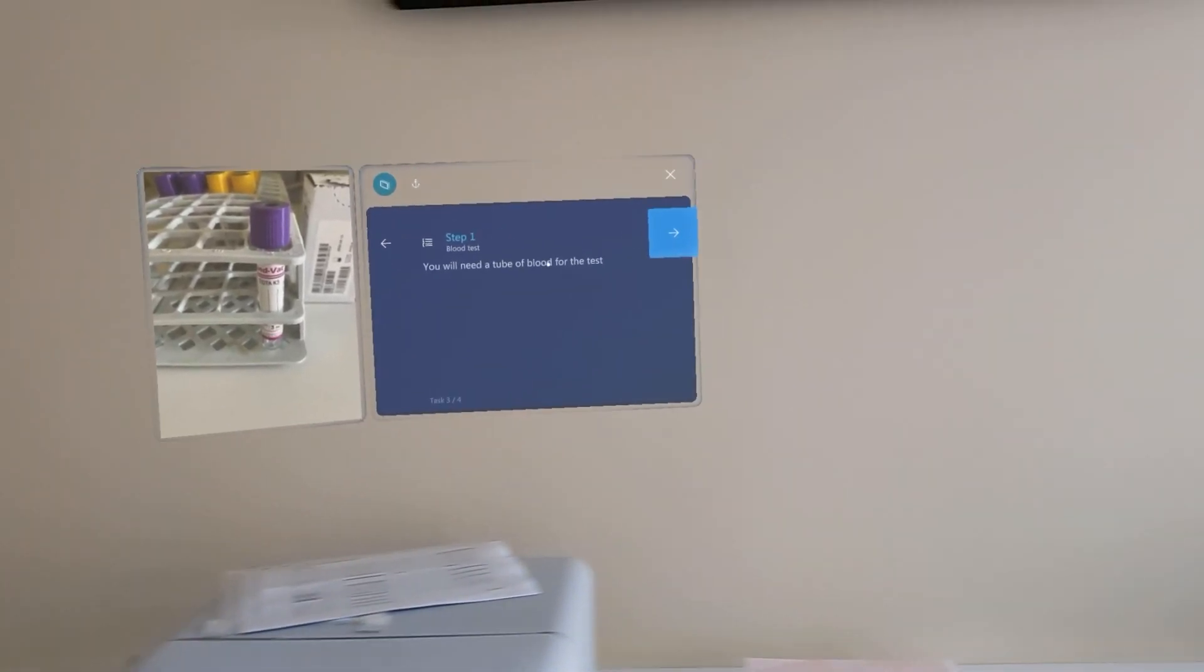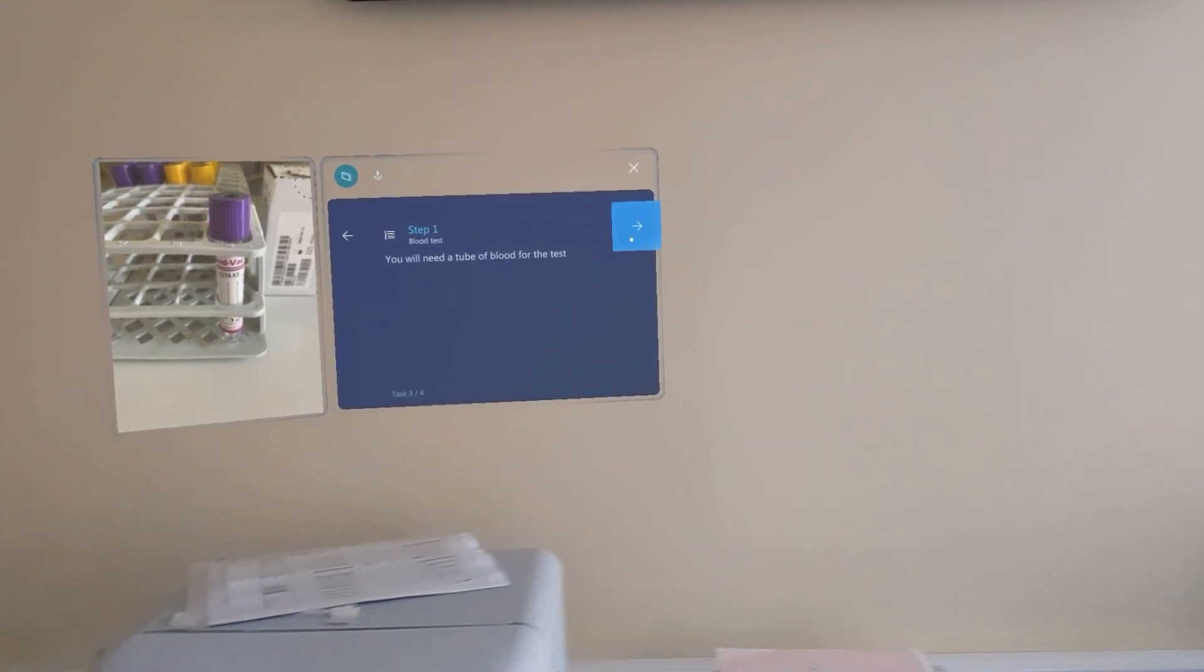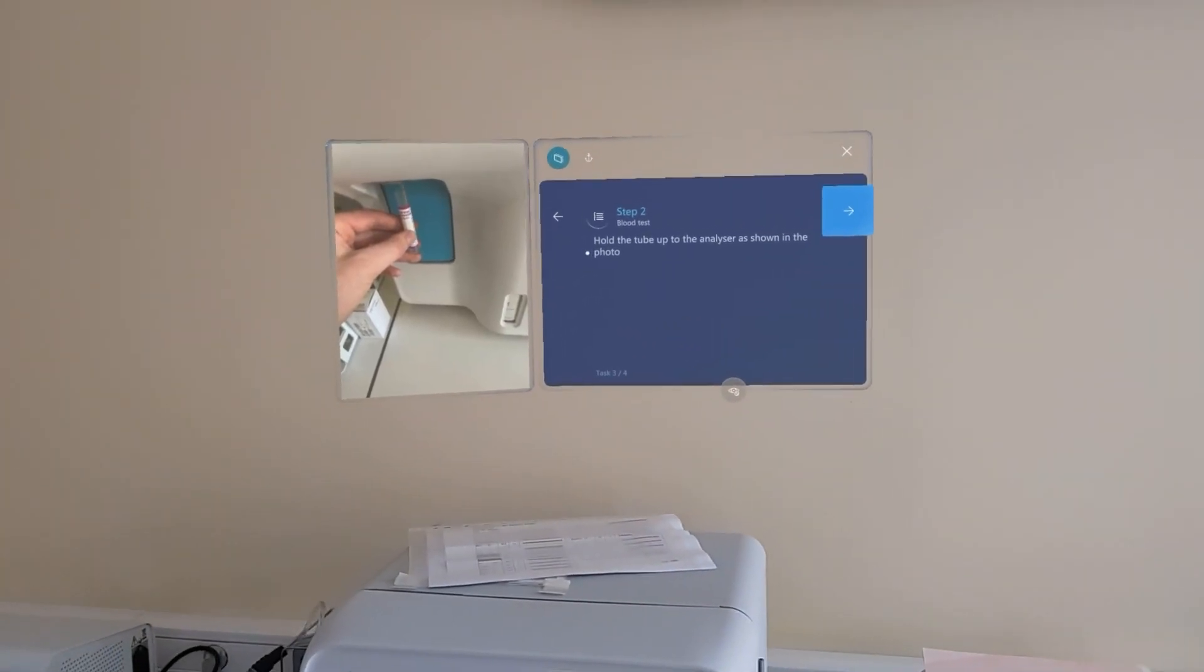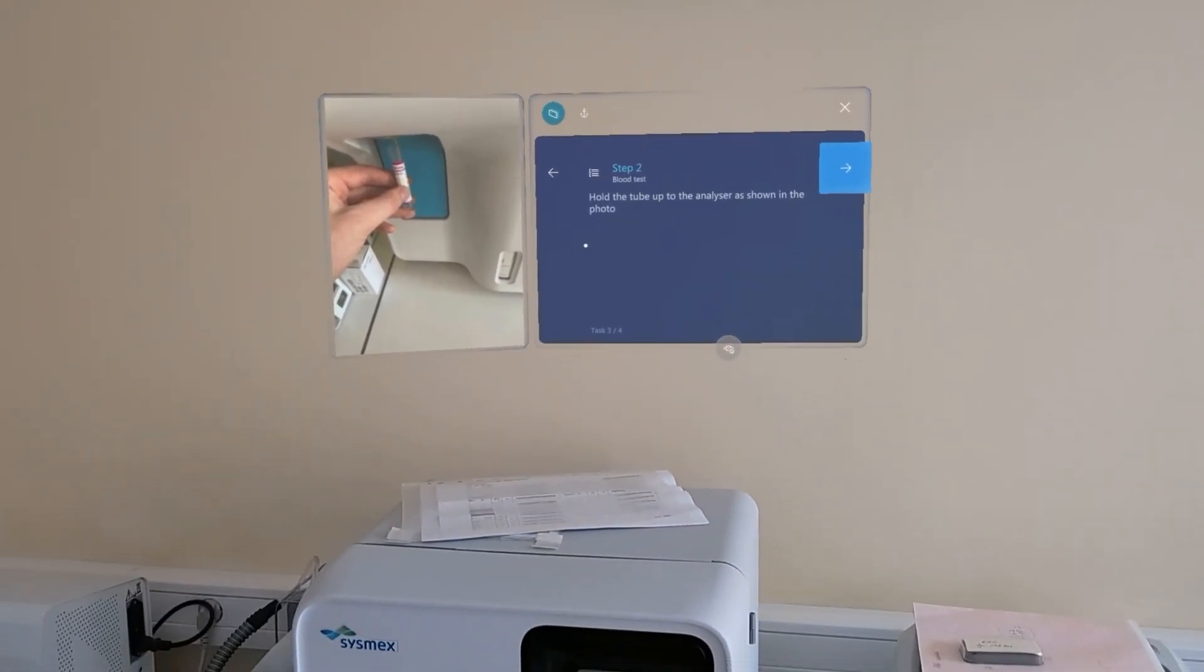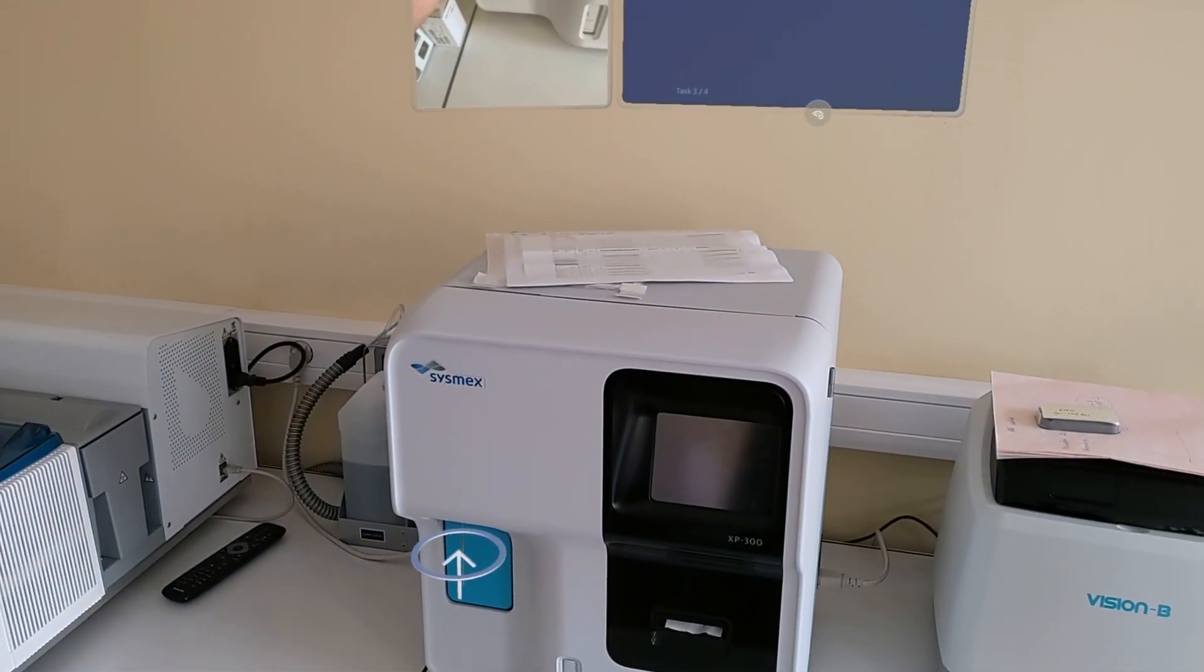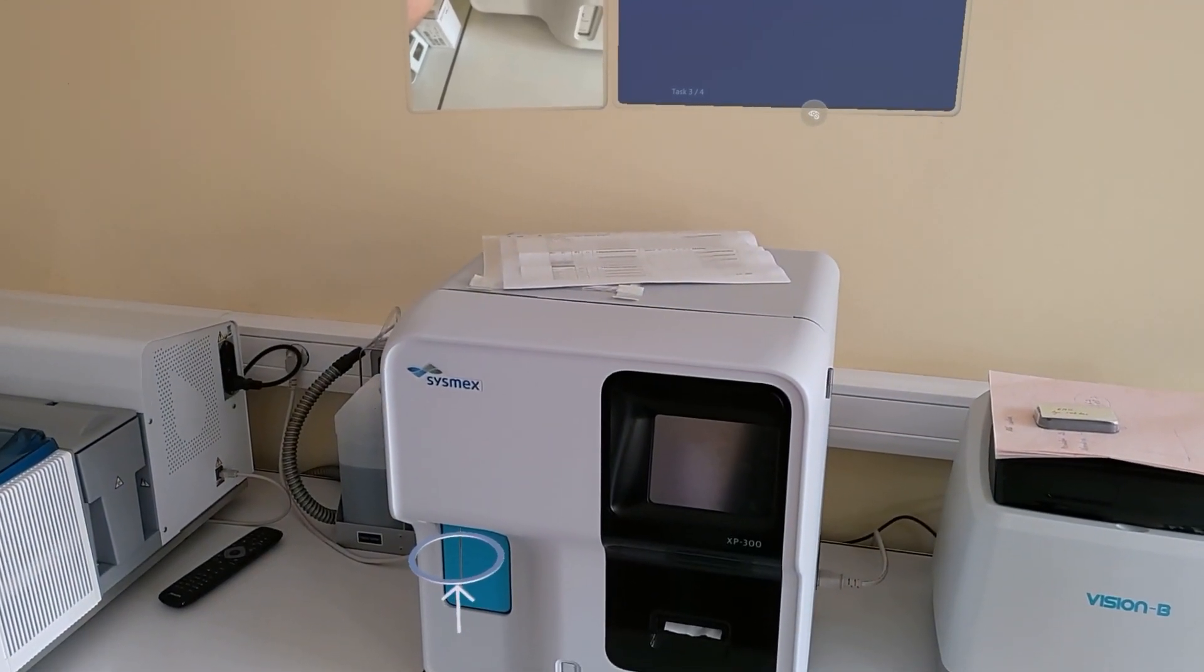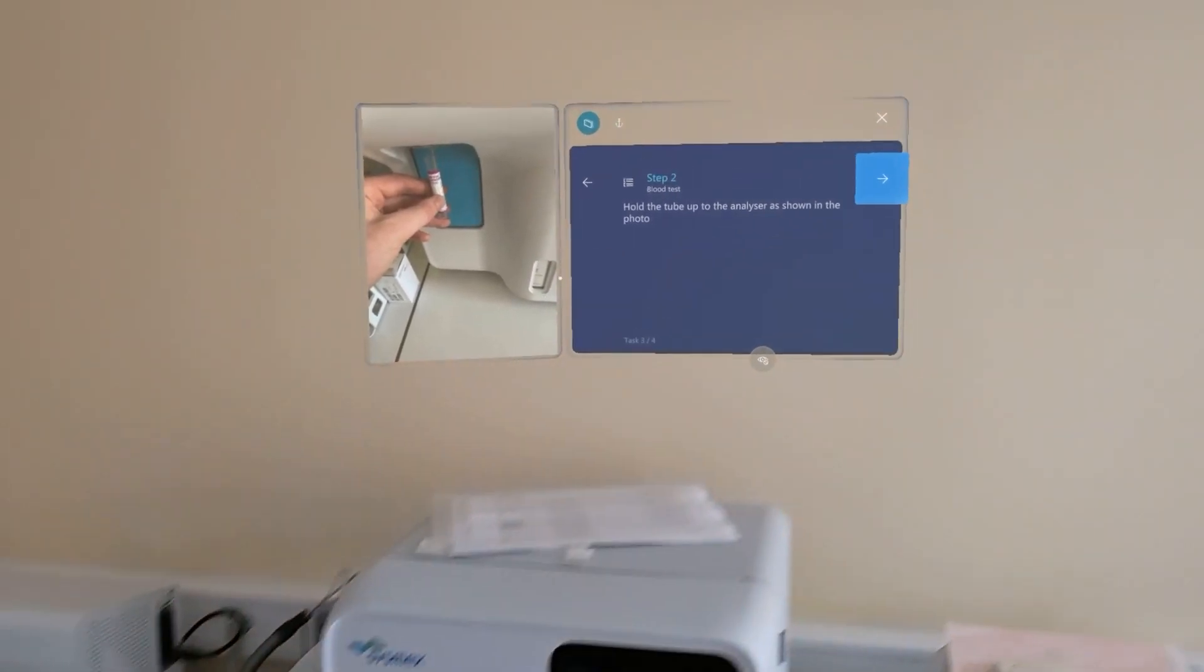The tube with the blood should be prepared. Hold up the tube to the analyzer as it's shown in the picture and hologram.